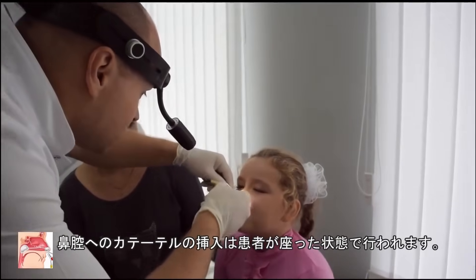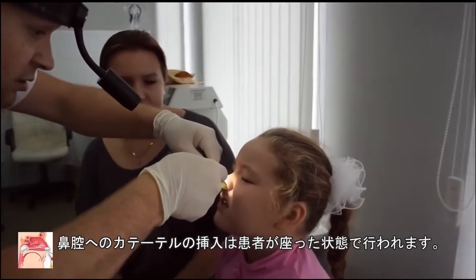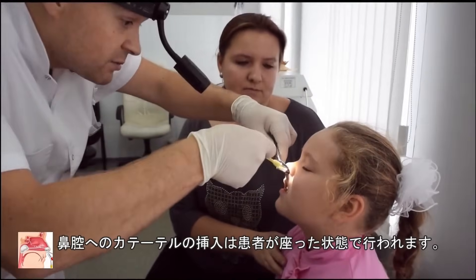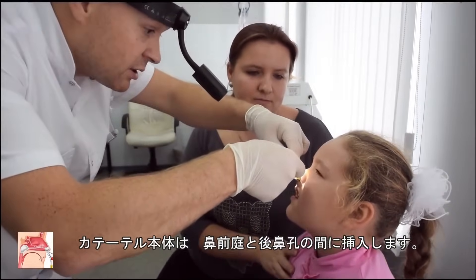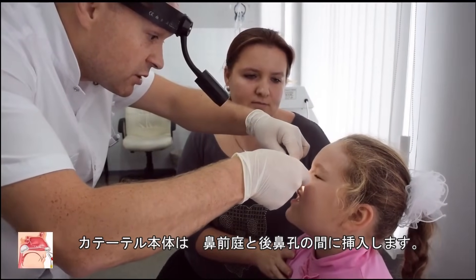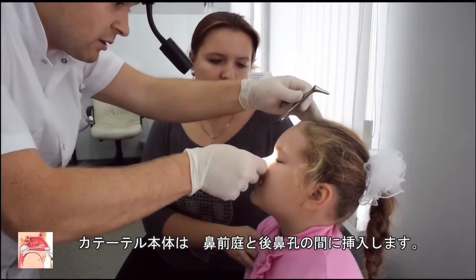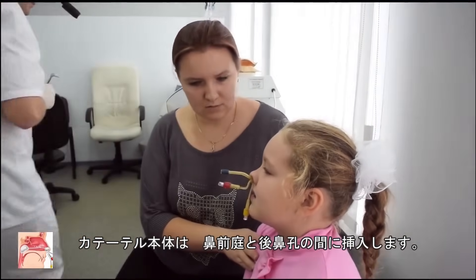Catheter introduction into the left side of the nasal cavity. It is performed with the patient in a sitting position. The catheter body was pre-bent so that the length of the introduced part of the catheter corresponds to the distance between the nasal vestibule and the choana.